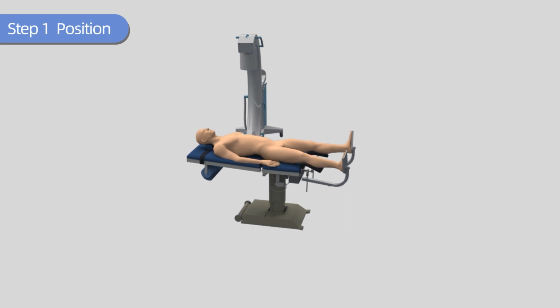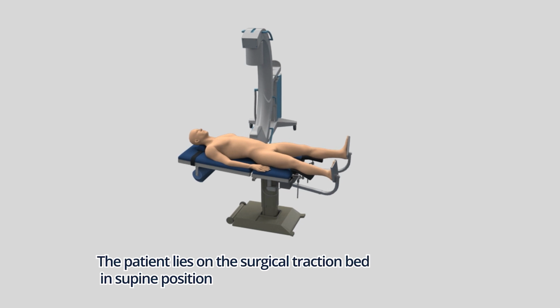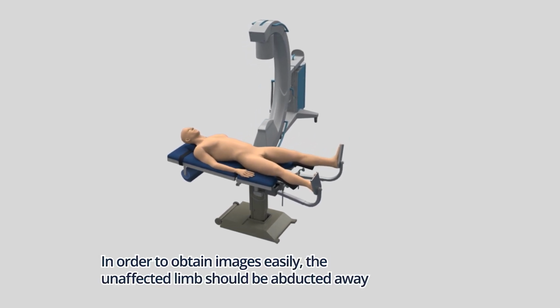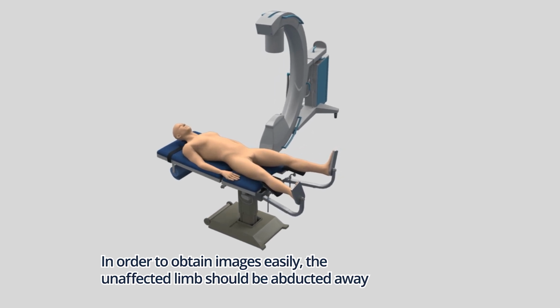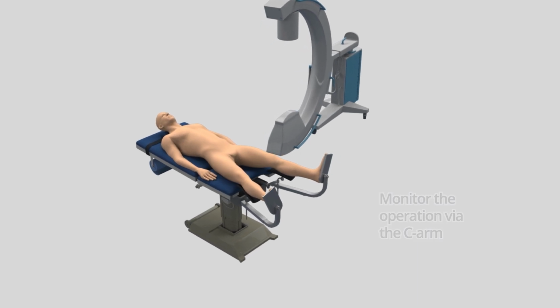Step 1. Position. The patient lies on the surgical traction bed in supine position. The affected limb is adducted and extended. In order to obtain images easily, the unaffected limb should be abducted away from the affected one. Monitor the operation via the C-arm.